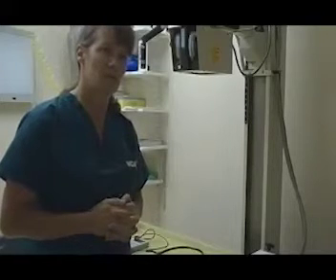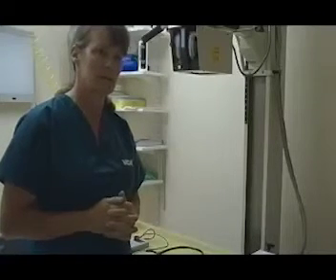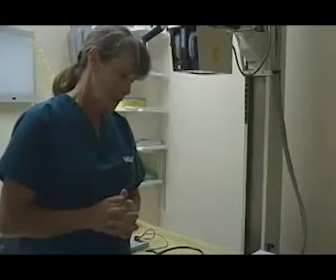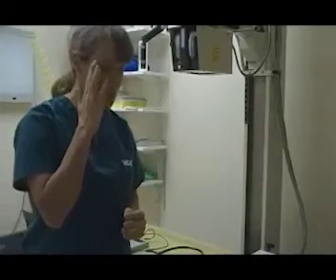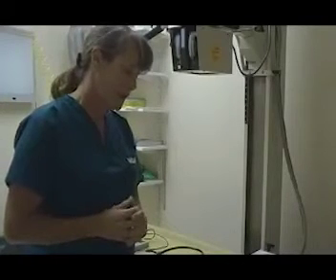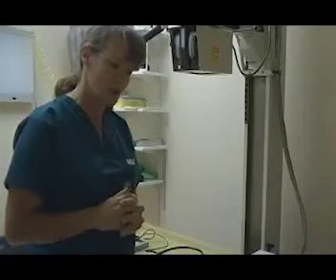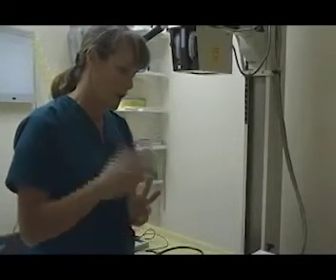During all of this time, of course, reflexes can be checked. One of the reflexes is the ear flick reflex, which can be elicited by tickling the ear, and it causes the ear to twitch. Another one is the palpebral reflex, tapping on the medial or the lateral canthus of the eye, elicits a blink, and generally that's in light anesthesia to medium. Jaw tone is observed in light anesthesia, should not be observed in medium anesthesia, and that's generally when intubation will occur. Being able to open and close the jaw.